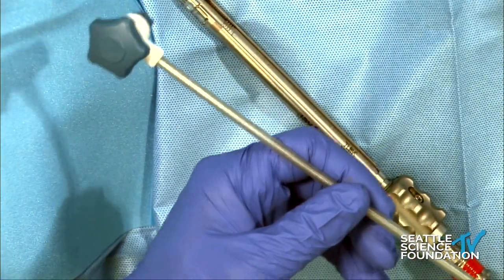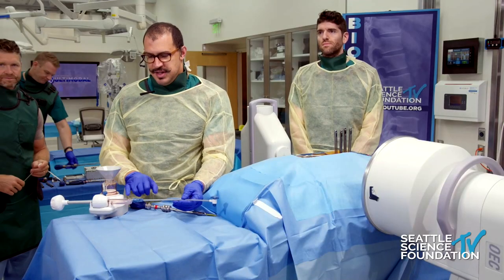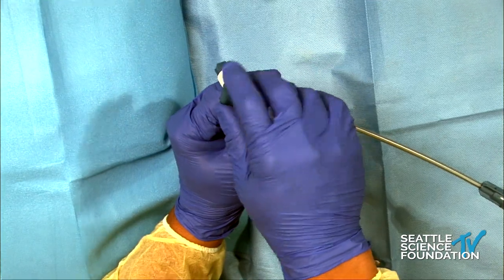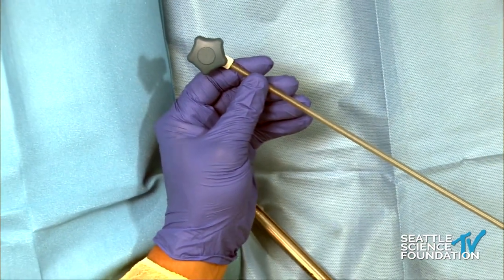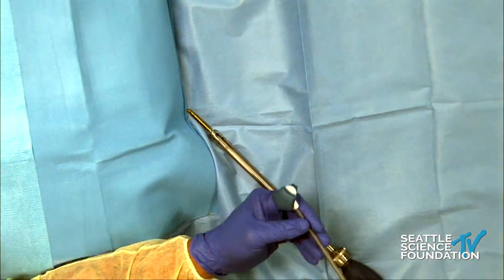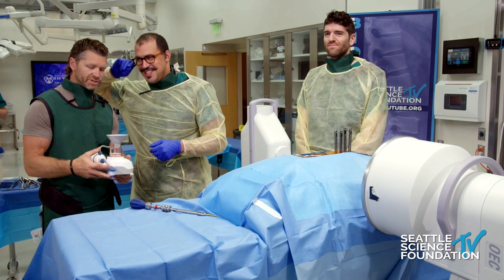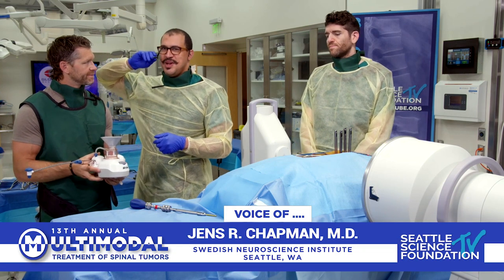These are the six holes where we want our cement to be, just to reinforce the strength of the screw and prevent pullout. So this system here — why don't you tell us how many cc's we get, because this will fill with cement. This is our application device; it fits right onto the top of our screw. This system has 12 cc's of usable cement, ready to go in about a minute, and then you have a 20-minute working time.